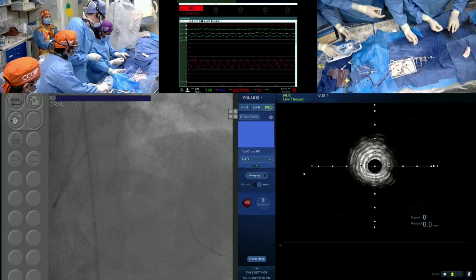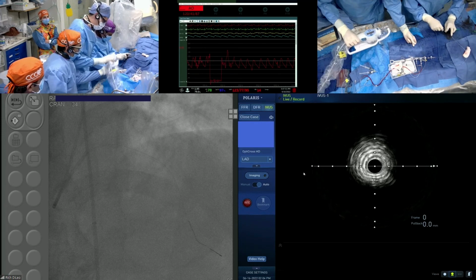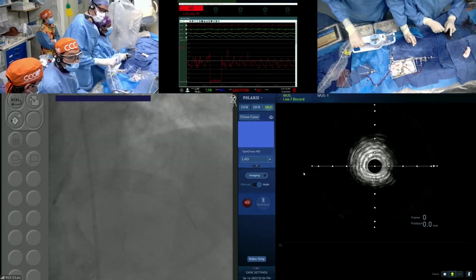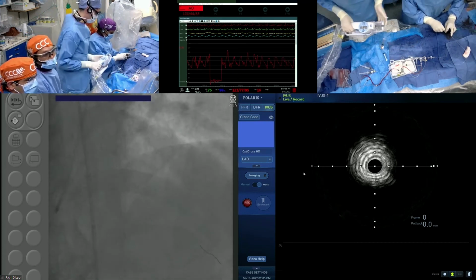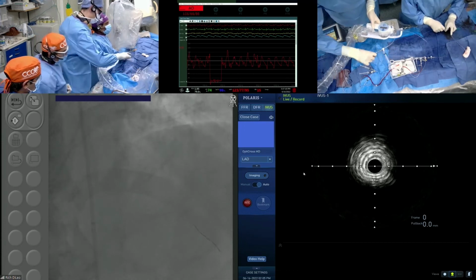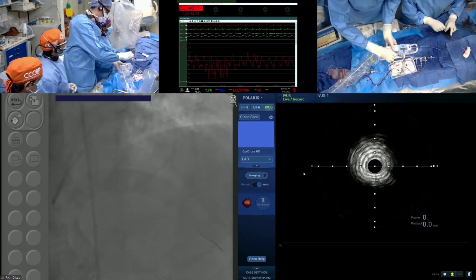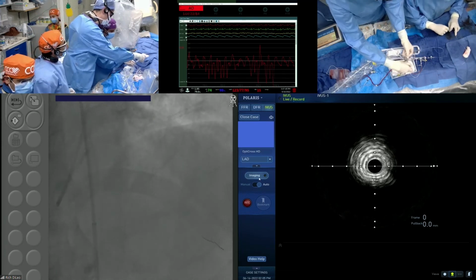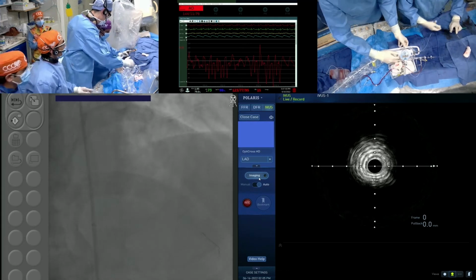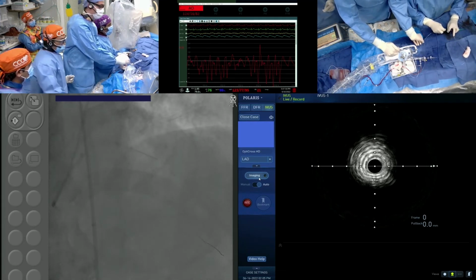Also, everyone's always worried about stenting across those aneurysms because you're going to, almost by definition, have 3 millimeters of malapposition. Almost, yeah. But that's not a concern. I can tell you there's absolutely no risk of stent thrombosis as long as you've got really good expansion of the stent. Right. And more importantly, by the time we are done with the stent, I can guarantee you this aneurysmal size will become half, as I mentioned, because of no flow.